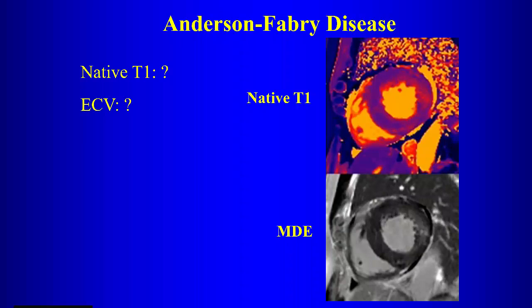Then fibrosis also occurs, and that would increase the T1. Yeah, so if there's fibrosis, then the two things kind of counteract each other, and that's called pseudonormalization, because fibrosis would usually increase the T1. And the ECV, what happens to the ECV?